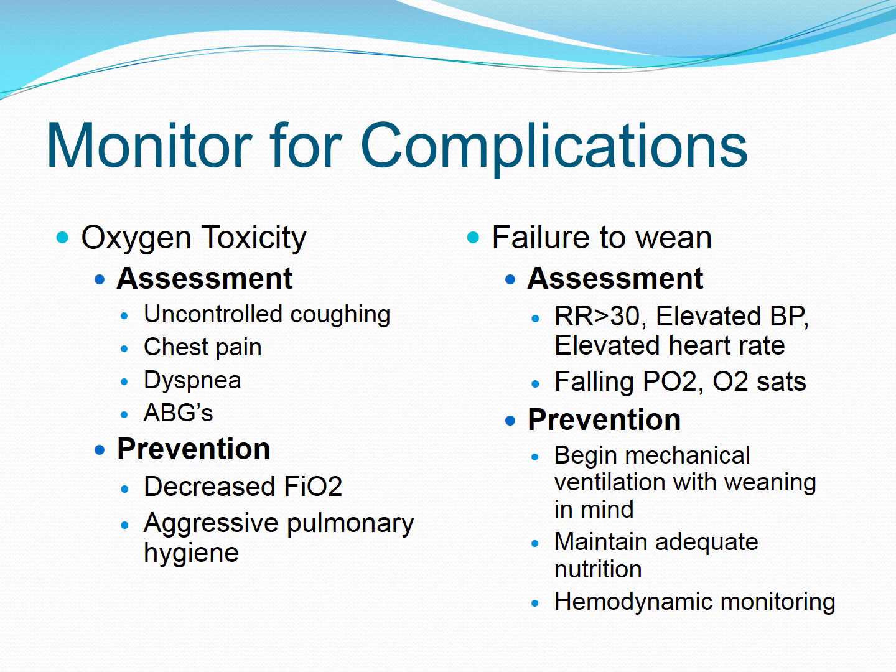getting oxygen toxicity. So basically our target FiO2 levels, we want to try to maintain the SpO2 greater than 90% and our PaO2 between 60 and 90. That's textbook picture. You may see that different actually in the clinical setting. So one of the things we need to do is monitor those arterial blood gases. What are they doing? Are we seeing dyspnea? So what we do is we have to try to decrease that FiO2, and we also have to be very aggressive with pulmonary hygiene on these patients.